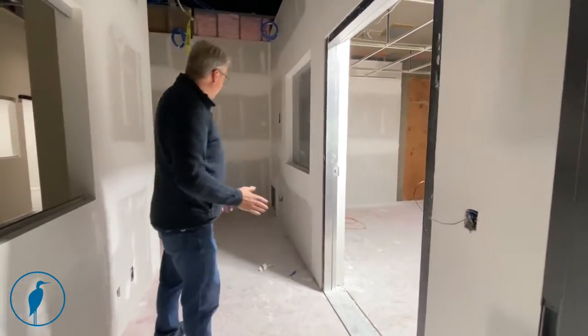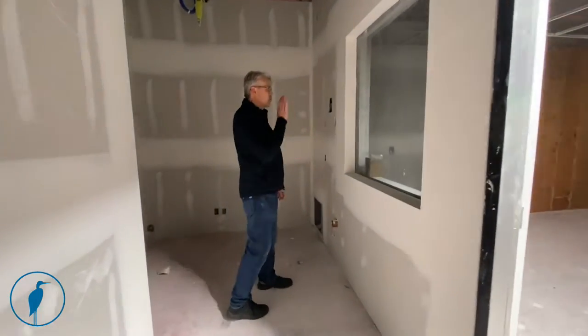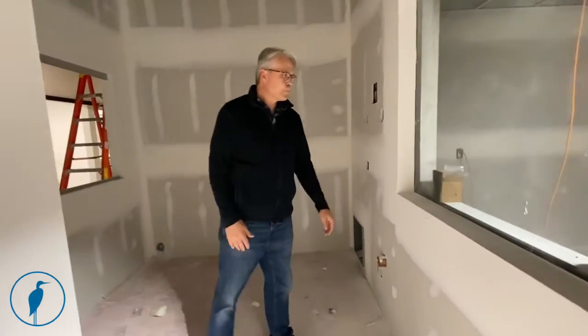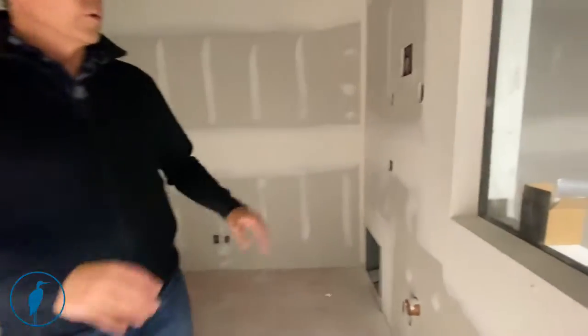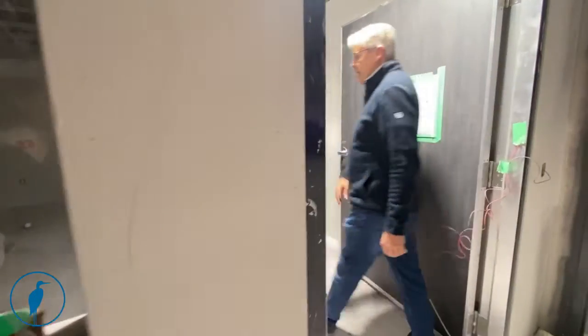There'll be one door here. This will be the operating area where the operator sits and can look through the window into the MRI room and control things while the patient is in there. And then in this area, this is the scanner itself.